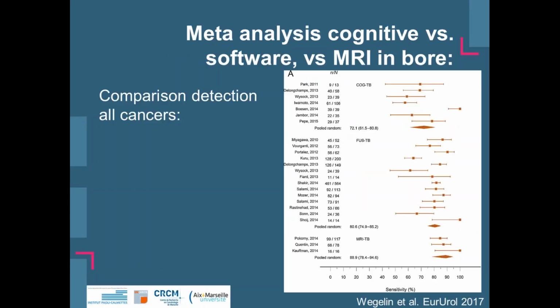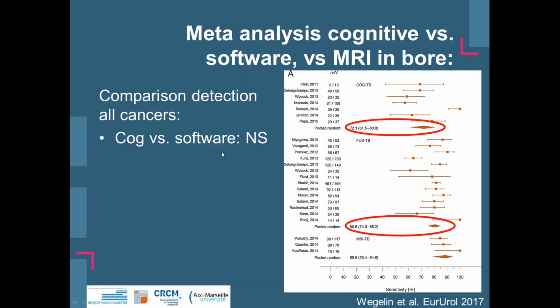There was just recently published a thoroughly done meta-analysis comparing the different targeting approaches, cognitive, software, and MR in-bore, and they had a look at the sensitivity for the detection of all cancers.